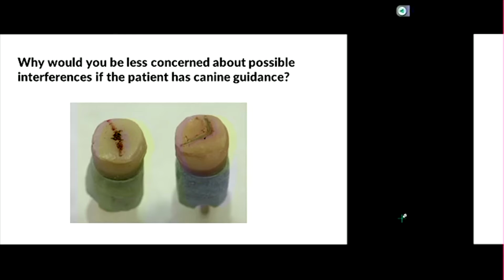So it's a lot of words, so go back and listen to that if you didn't follow. I'll try to explain it one more time, but the principle is correct. If you set it more shallow, it's one of the things you kind of have to visualize and think about. So if you don't get it right away, that's okay, but it's important to understand why. So if it takes you a little bit longer, you can either ask me or AJ. We'll do a great job explaining it to you.